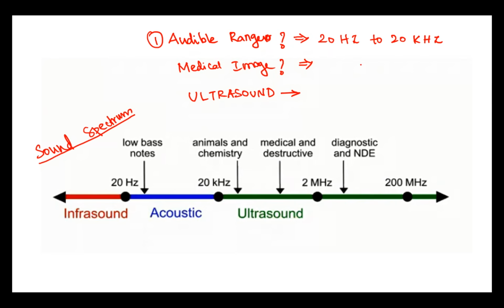Okay, right. Second question, medical image. In which range does this lie in this spectrum? For a human, we can hear sound in the acoustic region. For medical image, what is the range of the sound spectrum which you can use?